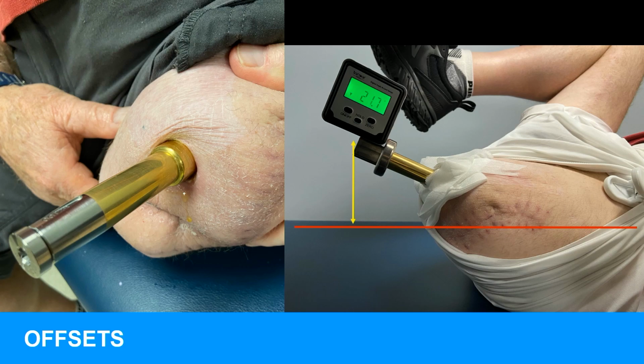What do all these have to do with my alignment? It's putting the alignment of the connector that far anterior. So we have to have offsets. A lot of people are concerned, should we have offsets? Do we need them? It's individual, each case is individual, but you're going to see in the next slide, we have to have some type of an offset.